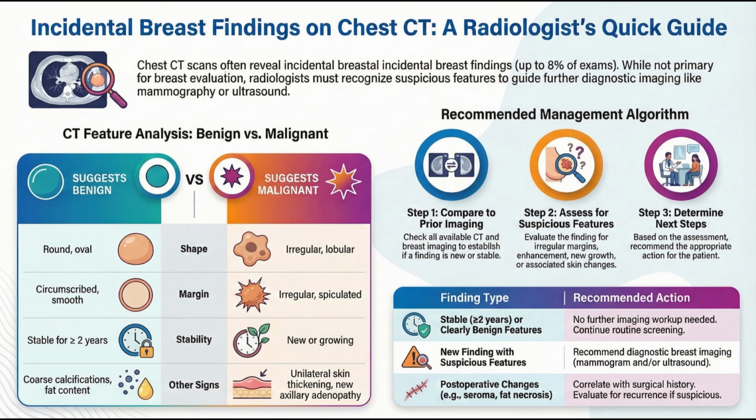But there's a key advantage to CT. A major one. The inter-observer agreement is better with CT. What does that mean exactly? It means if you show the same CT to 2 different radiologists, they're more likely to agree on the density score than if you show them the same mammogram. It's more objective.